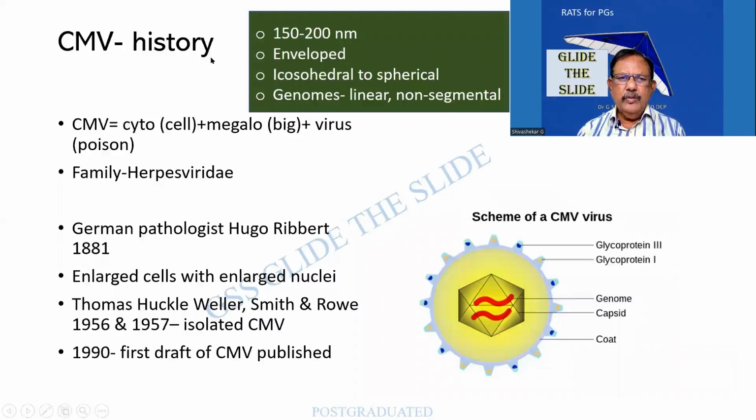It is a case of cytomegalovirus. The size can be anywhere between 150 to 200 nanometres. It is an enveloped organism, icosahedral to spherical in shape. And the genome is linear and non-segmented.